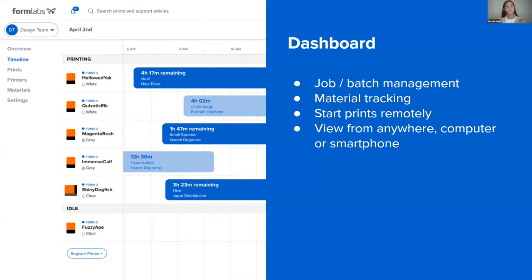So actually this is a very useful tool on the overall practice management, because you can keep track of your printers if you have more than one. So you can see all the combinations of your different printers, and you can decide how much time it would take, an estimate, and then you plan your practice according to this and your patient visits.